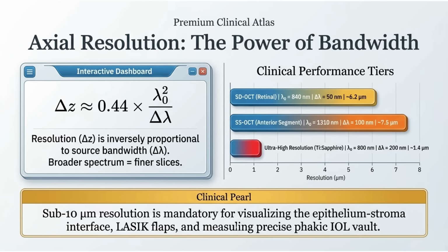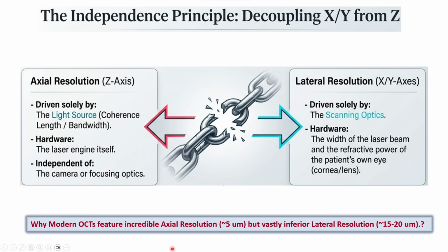Okay. Now, if we look at this slide, what I want to say here is that there is another term apart from the axial resolution. As I said, the axial resolution is when you take the scanning of the section along the z-axis, from anterior to posterior, so that you want to find the fine details of each structure.